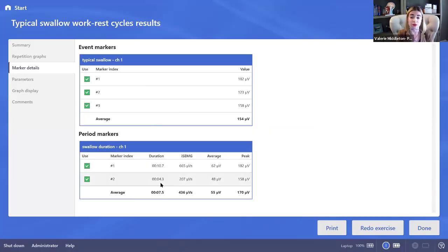And this is not unusual for a real patient, because as they're seeing this biofeedback, they can really grasp this concept and understand, okay, I see what you mean. I really need to swallow by this point. I need to stop all of my tongue movement. I need to stop the re-swallows, the coughing, whatever they're doing, and be done by the time they are out of the green or maybe before.